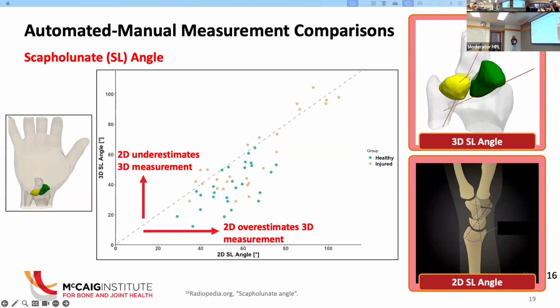Yeah, I haven't actually looked at the specific shifts between injured and uninjured, other than the differences between unloaded and load bearing. But I think it would be interesting to see that degree of shift, and see if there's any value in looking at it and if it tells us anything about the amount of rotation and translation that we get with those bones.